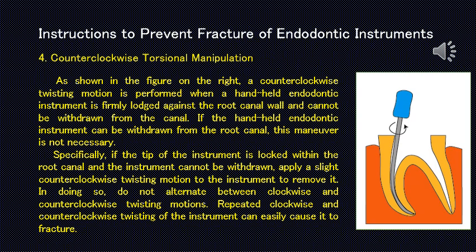Specifically, if the tip of the instrument is locked within the root canal and the instrument cannot be withdrawn, apply a slight counterclockwise twisting motion to the instrument to remove it. In doing so, do not alternate between clockwise and counterclockwise twisting motions. Repeated clockwise and counterclockwise twisting of the instrument can easily cause it to fracture.